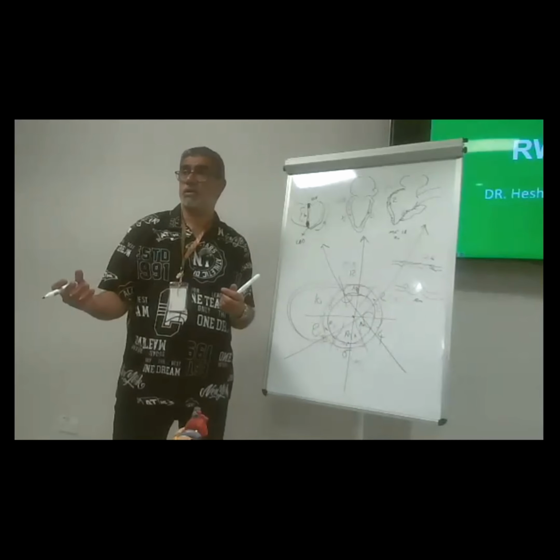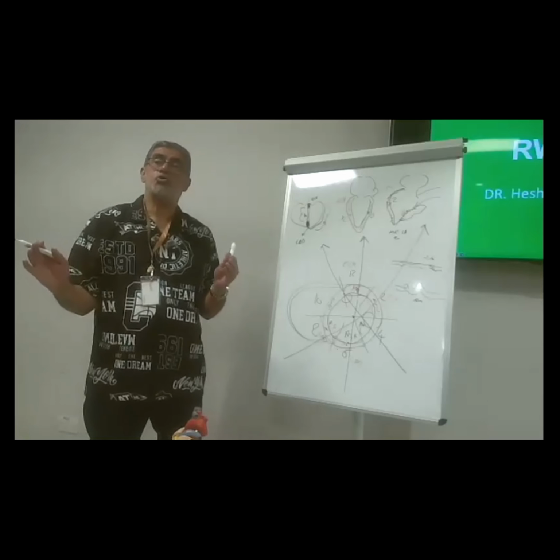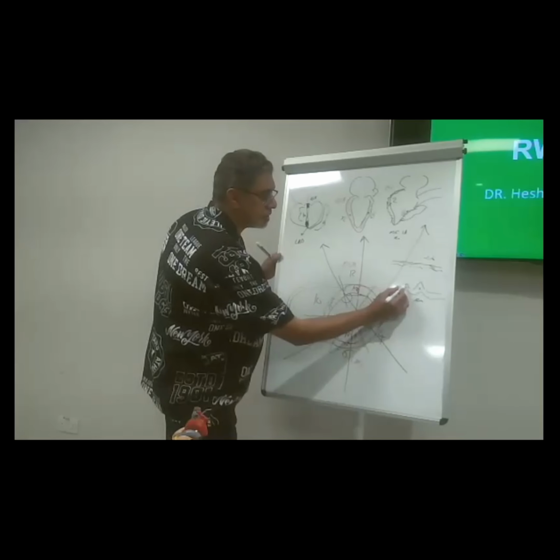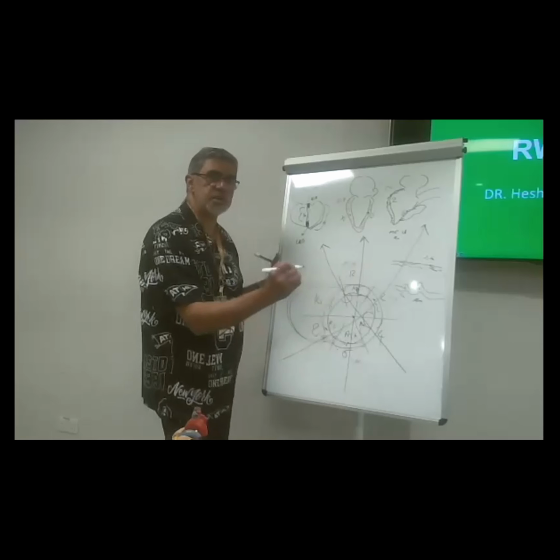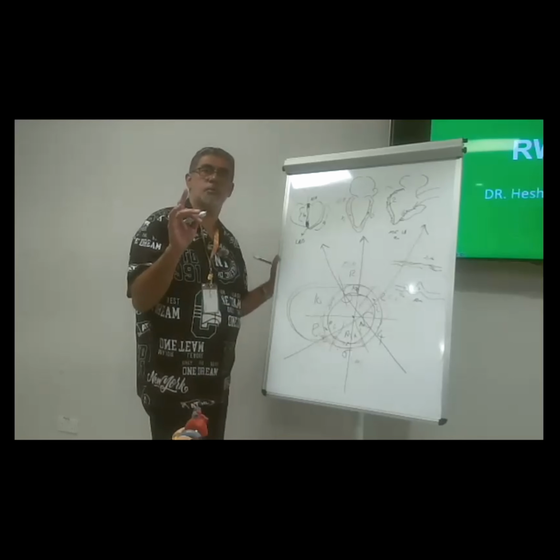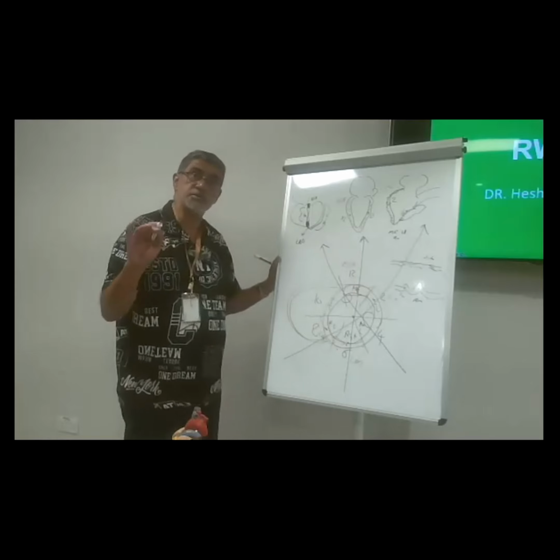In systole, thickening is increased, right? Normally, it should increase more than 30% of the diastole. So if this diameter is 5 mil, 30% means 1.5. So this one should be more than 6.5 to be normal. If it is less than 30, this is hypokinesia.